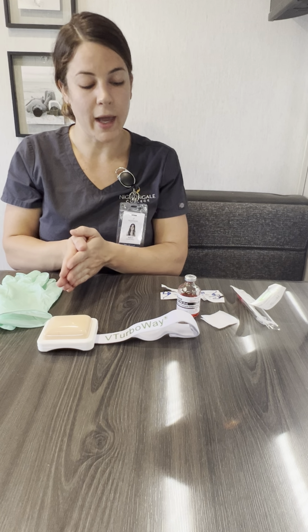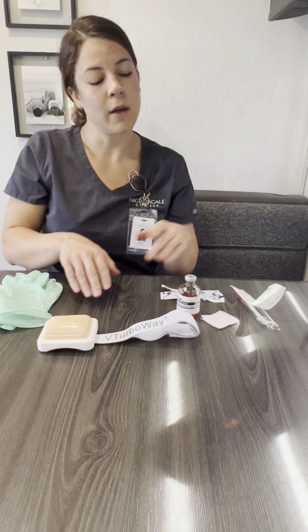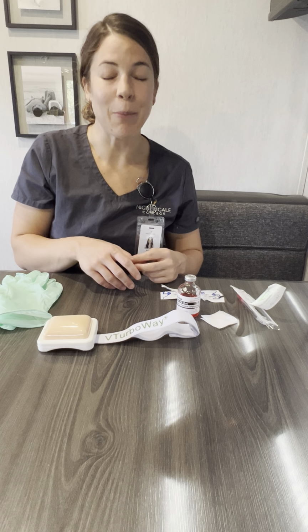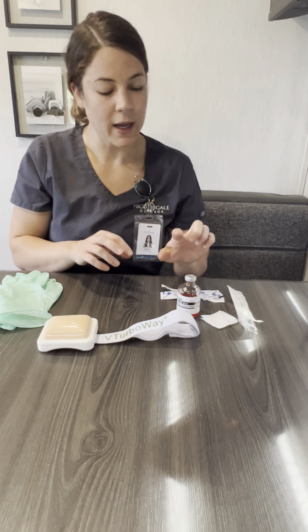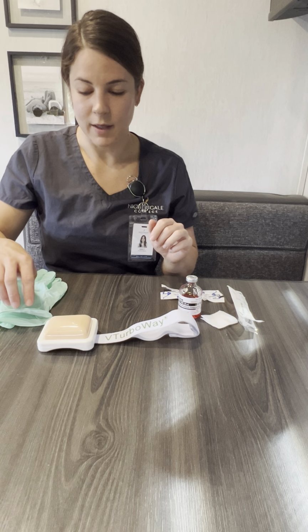Perfect. I'm going to go ahead and pull up the orders in the computer. I'm going to check in there and then I'll be right back to get started. I'm going to see that it is 5 TB units per 0.1 mLs of tuberculin, making sure I have the correct syringe again and the correct injection.